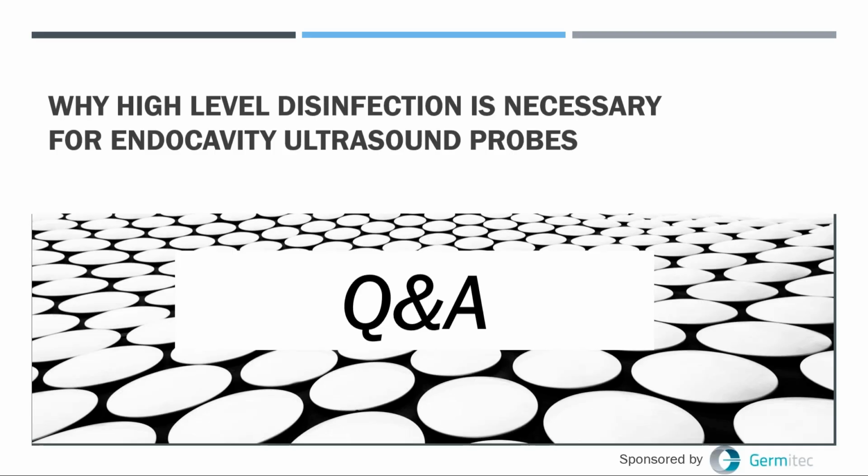The way those studies are done looking at probe covers, there are a variety of techniques one can use. One would be, if it's something like a condom cover, just take it off. You can fill it with water and look for small leaks. If it's a more solid material, you can use various methods such as filling the probe cover with electrolyzed water and then using technology looking for ions and others. So probe covers, even though they're not visibly leaking and have holes in them, often will tear or leak. That's the first issue.